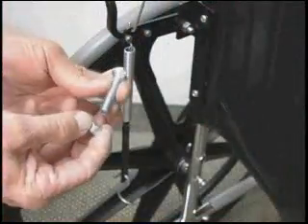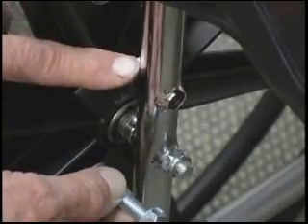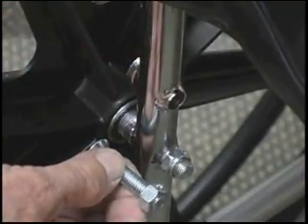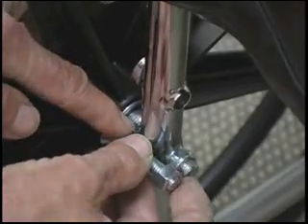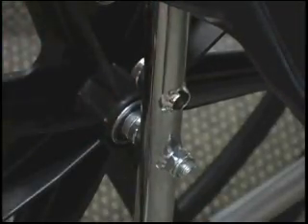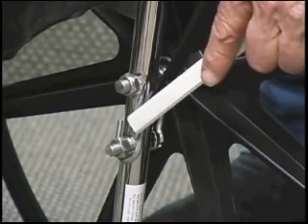Following this procedure on both sides of the wheelchair, the wheels of the chair are removed and then resecured in the upper hemi height position. While the wheels are off, a new anchor bolt is placed through the standard height bolt hole and secured with the nut to the inside. The spring tension anchor hook is then hooked to the newly placed anchor bolt.